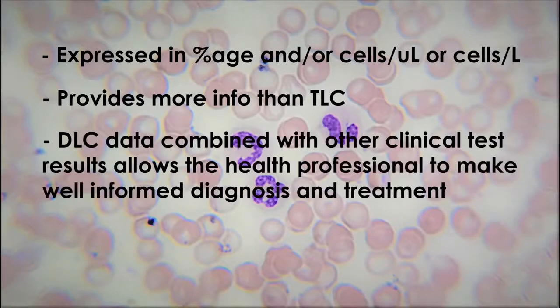patient. Combined with the various other clinical test results of a person, the data on DLC count can guide the medical health professional through a well-informed medical diagnosis and subsequent treatment protocols of the disease that the patient might be inflicted with. The DLC procedure is a pretty simple process and can be performed in a modest lab setting.